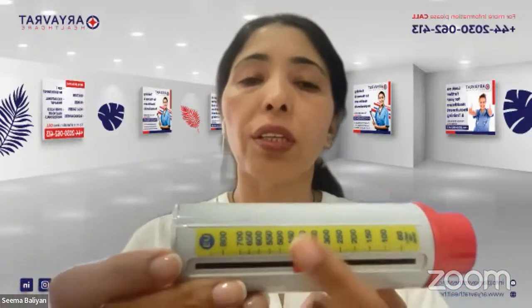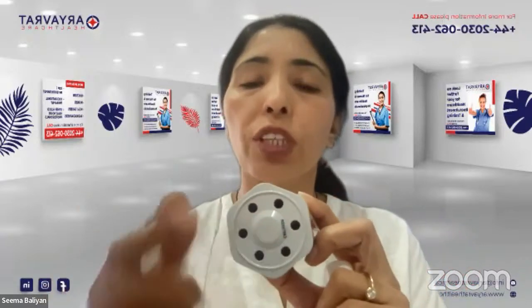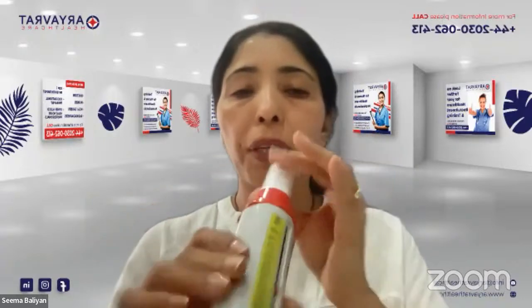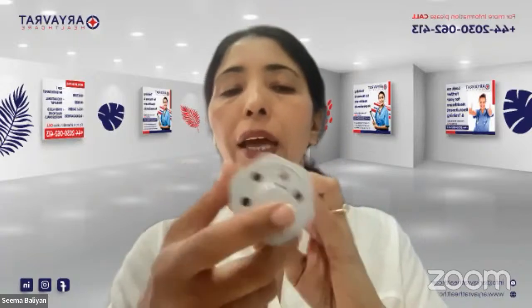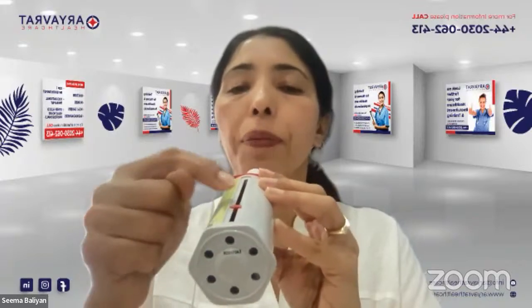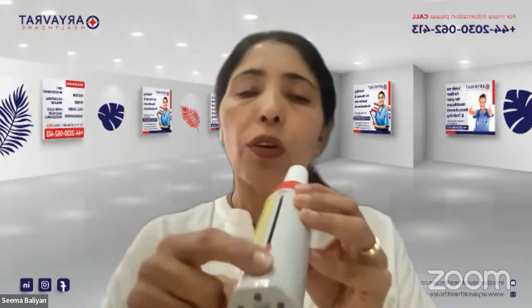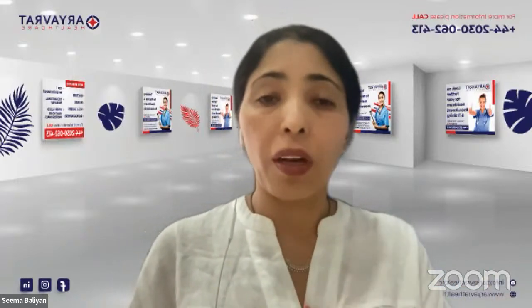So the plunger, the scale, and in the end, there are these holes, which are like vents. You are going to be blowing air into the mouthpiece, and the air goes out from these holes. But while doing that, with force, it is going to push the plunger out, and the plunger is going to indicate a certain reading. So you'll see that it is a very simple device. It is not complicated at all.